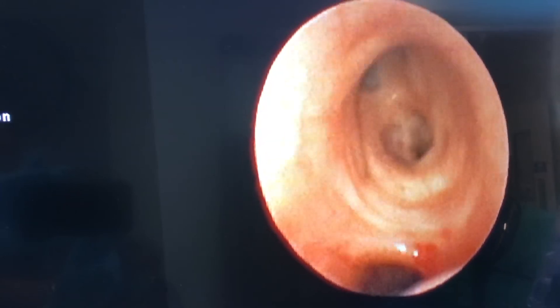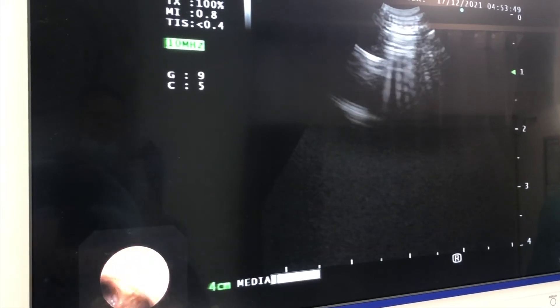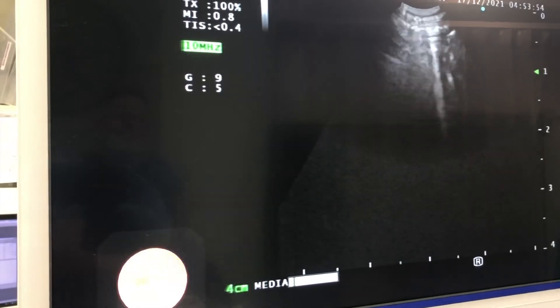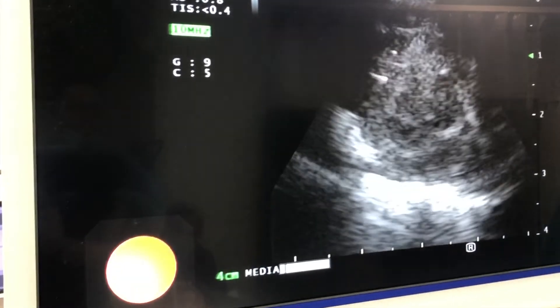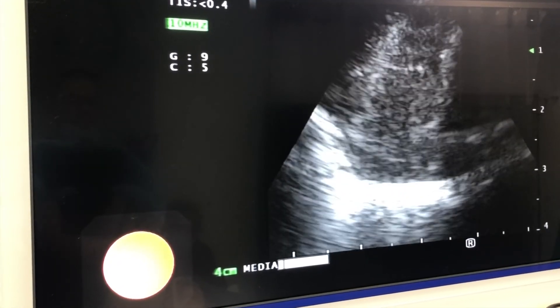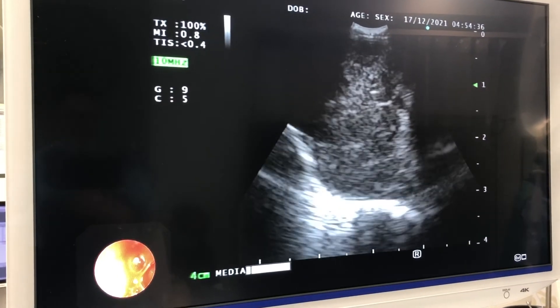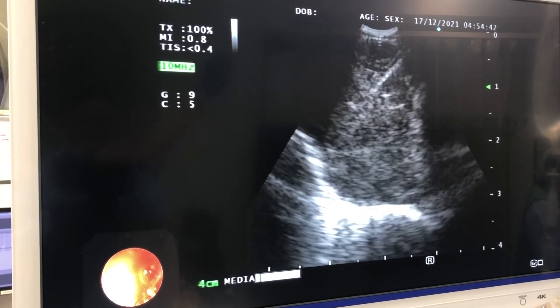Firstly I just wanted to have a look down the left main bronchus to make sure there's no endobronchial lesion. There's the left upper lobe, and going into the left lower lobe we can see that it's patent with no endobronchial lesion. This is the EBUS view — we'll place the EBUS scope down the left main bronchus and hold the ultrasound up against the wall, and we should be able to find the lesion. There it is — you can see it's got a hyperechoic border, it's heterogeneous, and it's quite a significant mass.